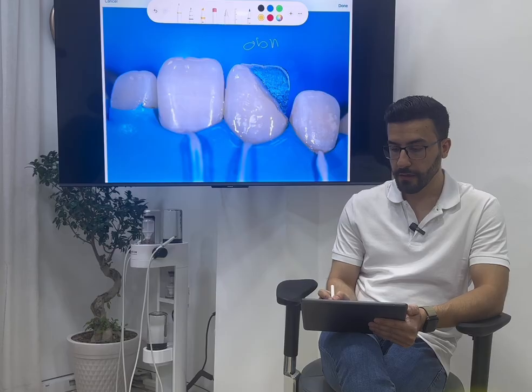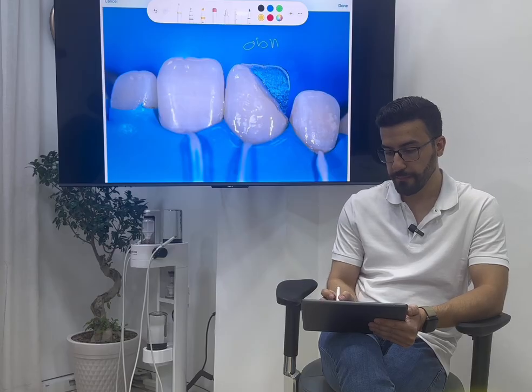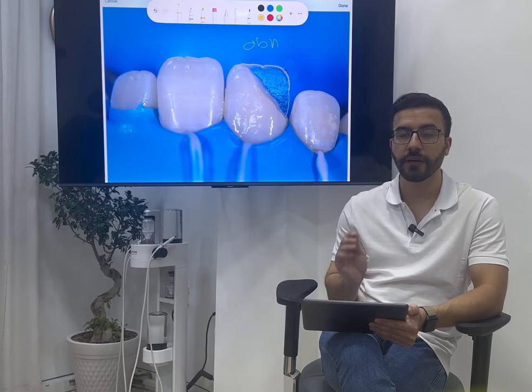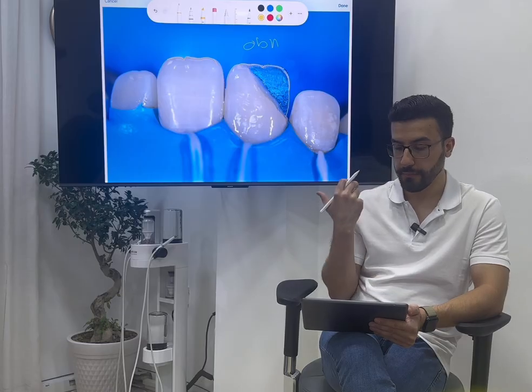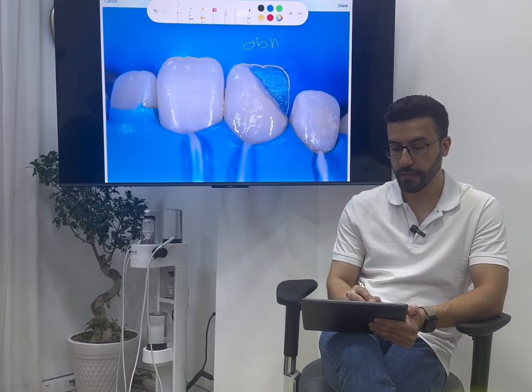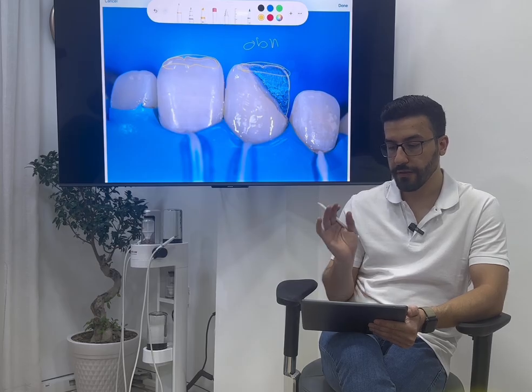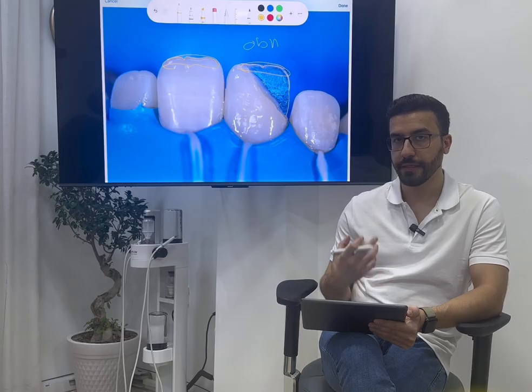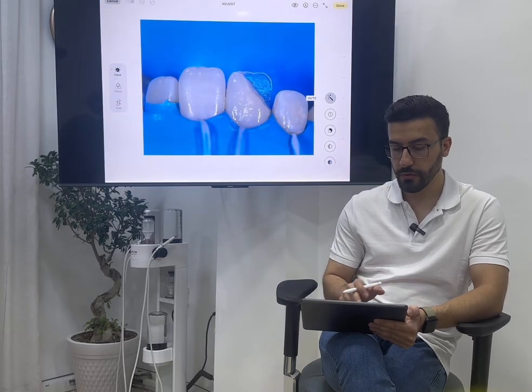Here I created the zigzag that I have on the adjacent tooth, and here I use a translucent enamel because I have translucency here, so I have to create translucency like the adjacent tooth. With the help of a silicone index, I will do this step.